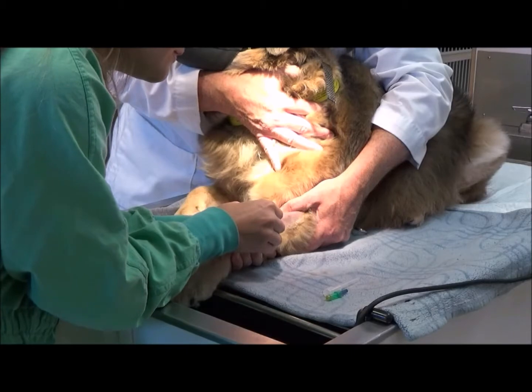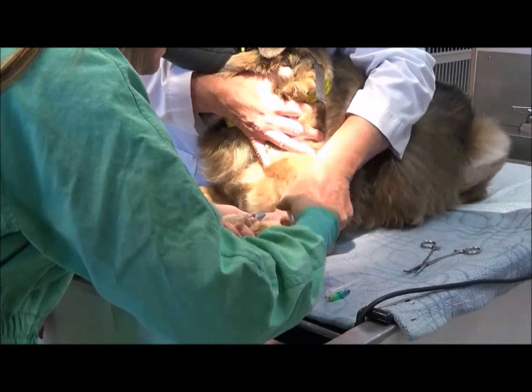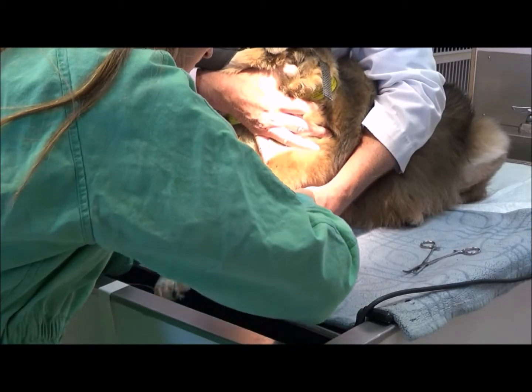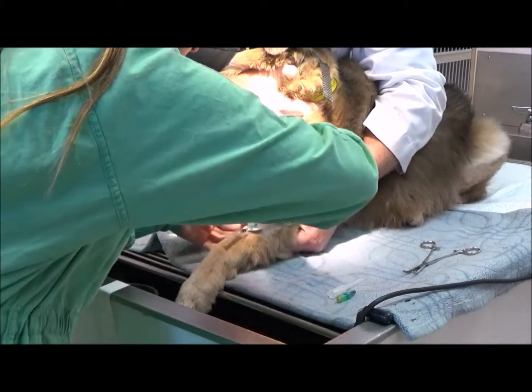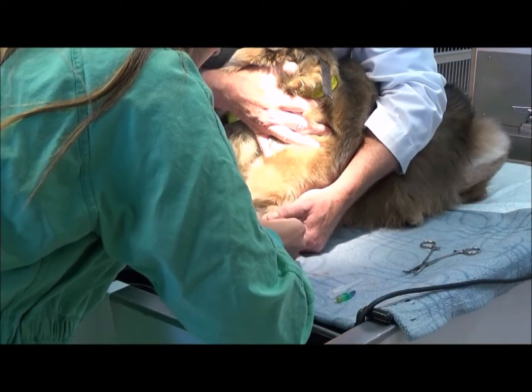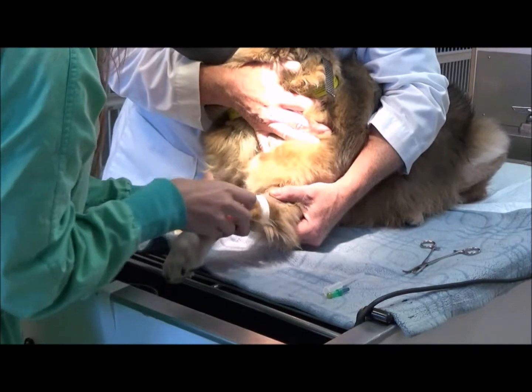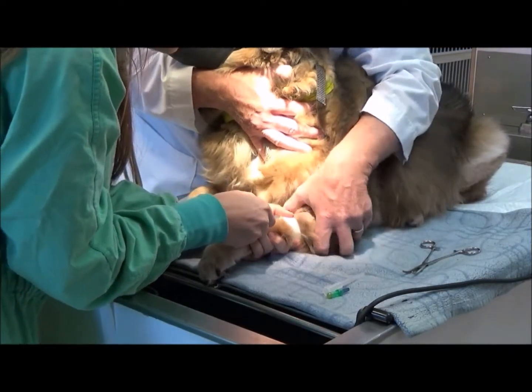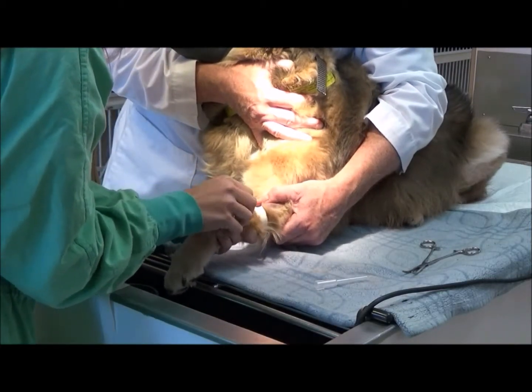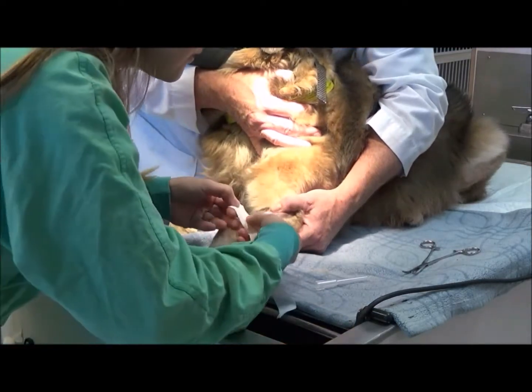Once you see your flash of blood, you're good to fully insert the catheter. And then use a piece of tape to secure the catheter in place. Okay, now that the tourniquet's off and we're holding down on the catheter, we'll go ahead and take that out. Screw down the male adapter plug, and then you want to secure that into place as well with a piece of tape.